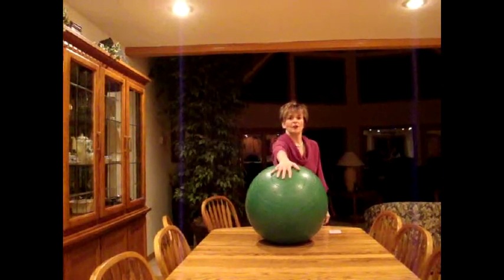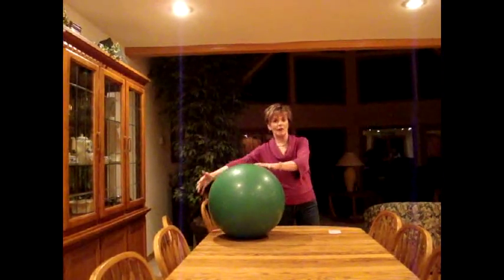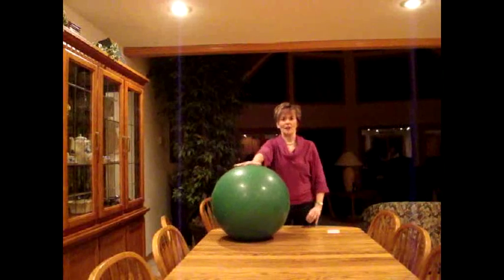But you just want to put your hand on there and push it up as far as you can go, bring it back as far as you can go, take it to the side as far as you can go, and my hand would fall off and I'd have to pick it back up and put it on and take it to the other side as far as you can go.